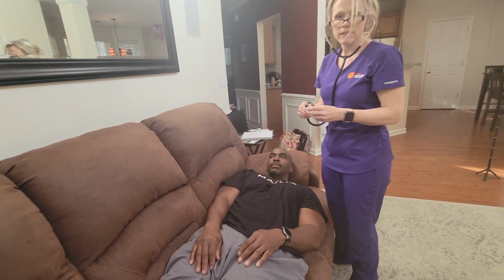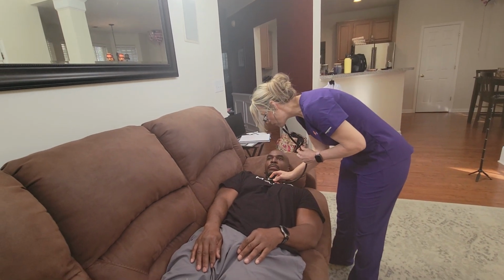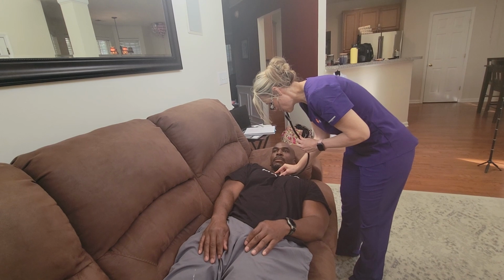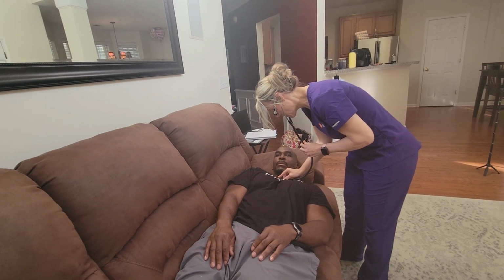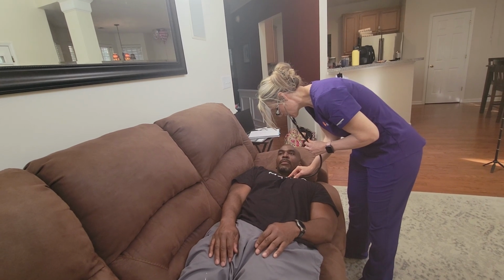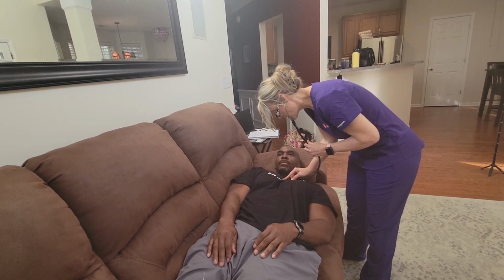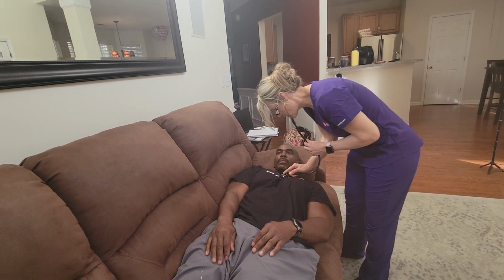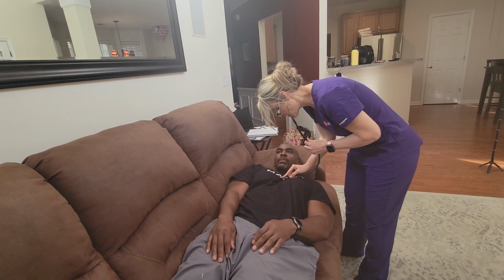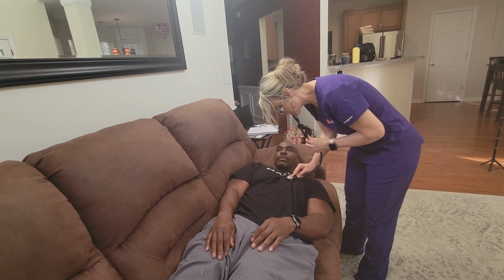Now I'm also going to listen with the bell of the stethoscope in the same places. So the aortic, the pulmonic, Erb's point, tricuspid, mitral.